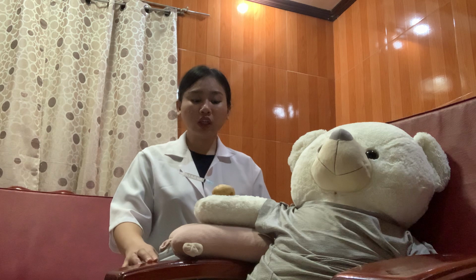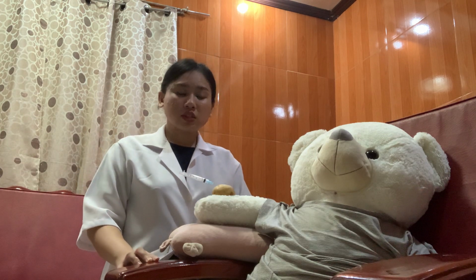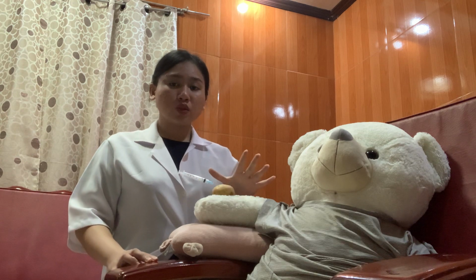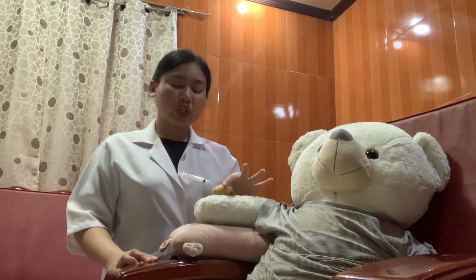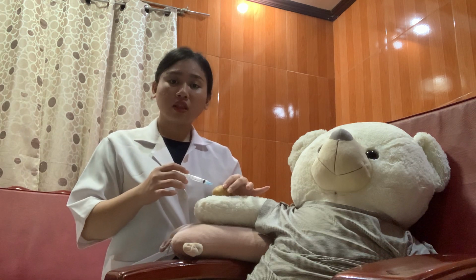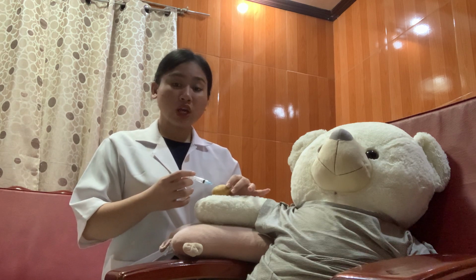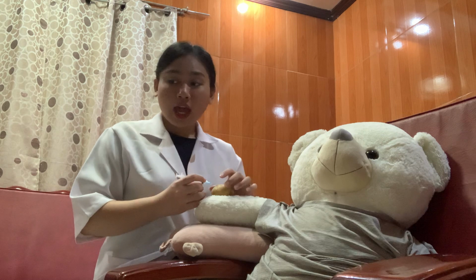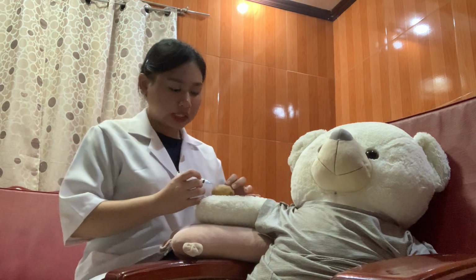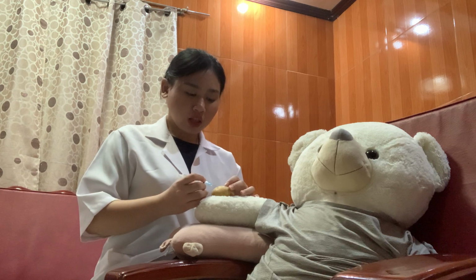After that, we must obtain 1 to 3 ml of specimen. This allows us to recheck and add additional studies if necessary. And then we withdraw the needle while stabilizing the barrel of the syringe.